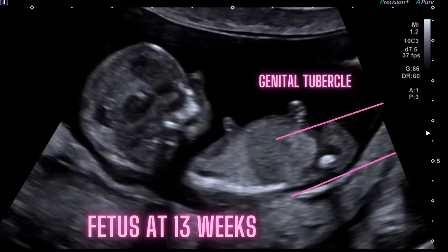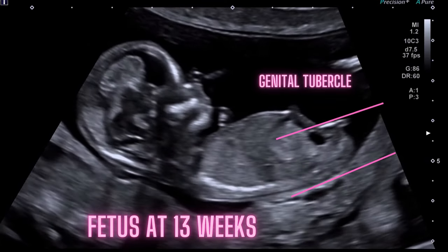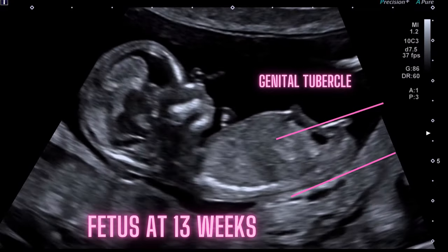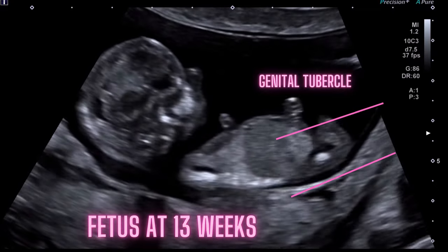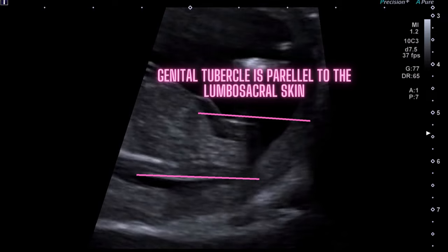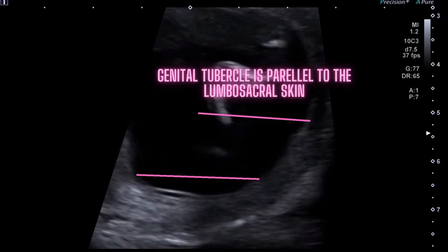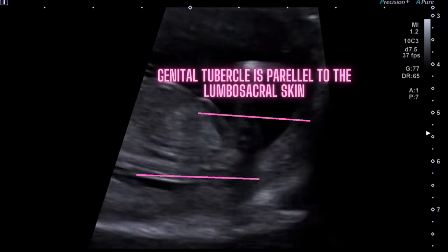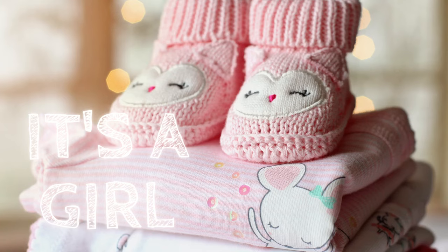This is a 13-week-old fetus. At this gestational age, we identify the gender by observing the direction and the angle of the genital tubercle. The genital tubercle is parallel to a horizontal line through the lumbosacral skin surface. Also make sure the fetus is examined in a natural position, mid-sagittal plane. It's a girl.